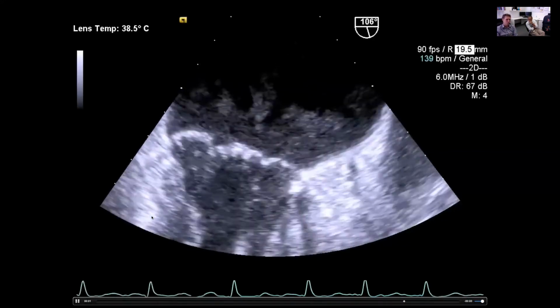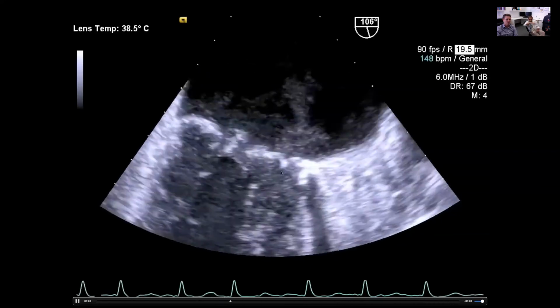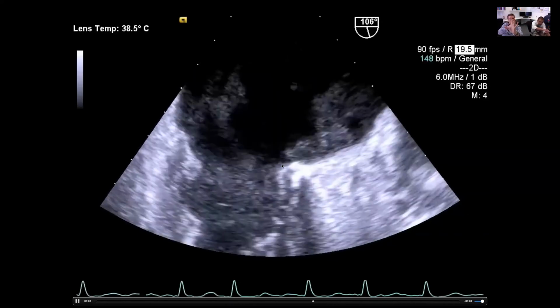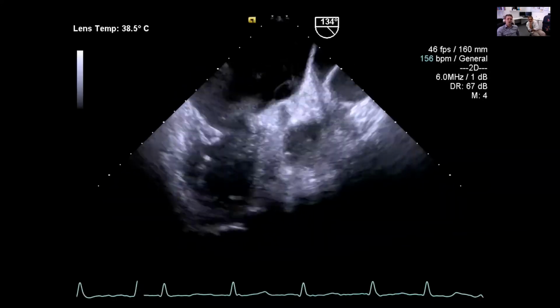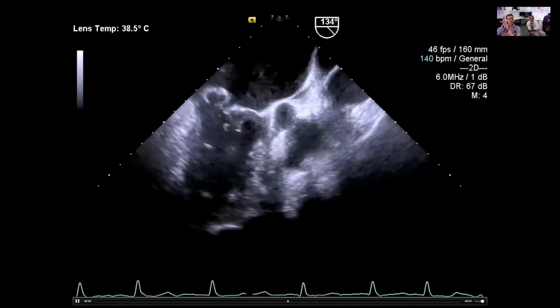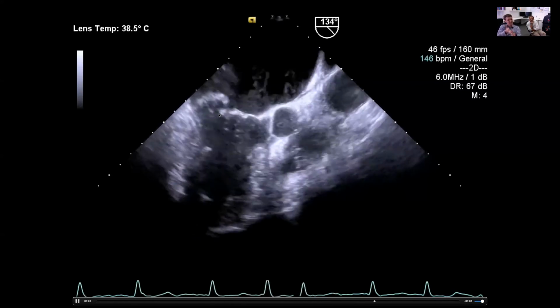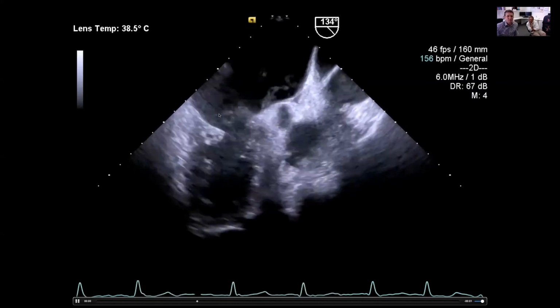At 106 degrees, we're probably looking at P1, and here's A2, and here's A3 or P3 probably there. Does that make sense? Yep, around like that, or P3 like that. At 130 degrees, which scallops are these? So this is the P2 still. Yes. And probably would be with A1. I think A2. A2. So 130 degrees is across like that. Yes, very nice.